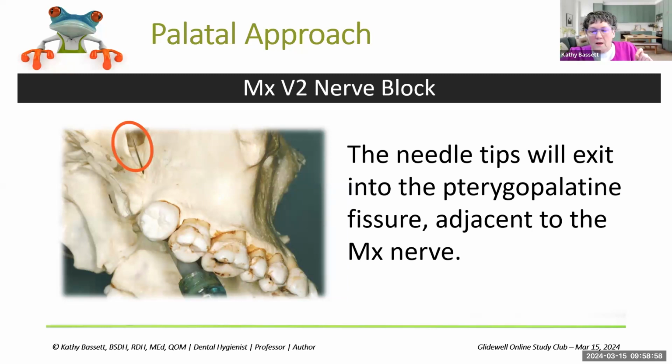In this one, it is important to be careful. A lot of people aren't comfortable navigating that canal. If you have any resistance, the instruction is to pause. And then the biggest piece on that would be, they also find that if you just even partially engage and go ahead and give it, many times you can successfully capture that, even if the needle hasn't navigated that full 30 millimeters up into that space.